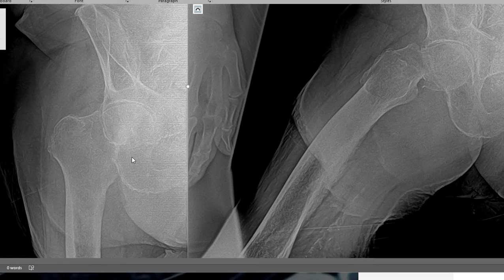And one thing I want you guys to all notice is even though this patient was in pain, they had no problem doing the frog leg view and the AP view of the hip, which again is going to be very important when we're trying to make our diagnosis. And this way, when they get to the ER, when they get to the hospital, they have the images, they have the report, and at this point, the orthopedic surgeon can start deciding what they want to do with the patient in terms of treatment. If we send them with one view of the right hip, they show up there, again, the orthopedic surgeon is going to have to repeat all the exams of that hip, so they're going to have to start over. So it's important that we get both of these views along with our AP view of the pelvis.